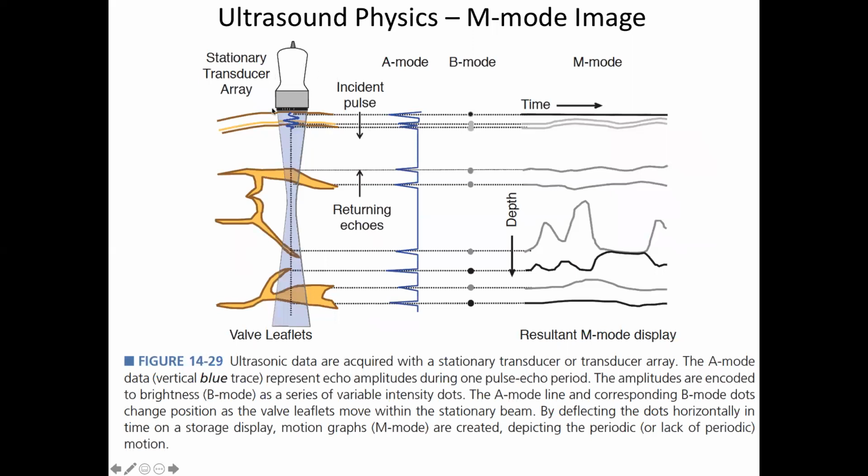So when we look at it in the context of an object that we're trying to image, this is a chest wall here of the patient, and we place the transducer right on the chest wall. And we'll discuss, it's not the actual piezoelectric crystal that goes onto the chest wall. You couple the piezoelectric crystal to a softer material than the piezoelectric crystal.